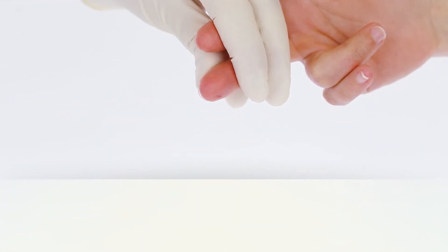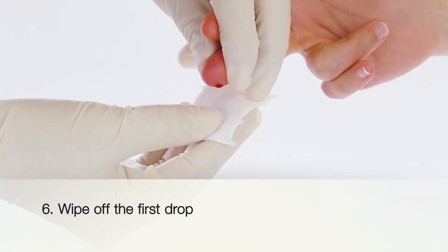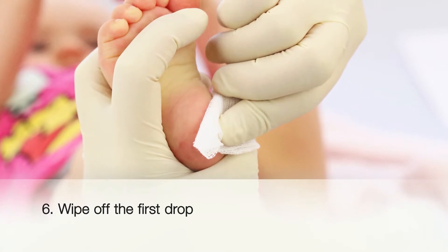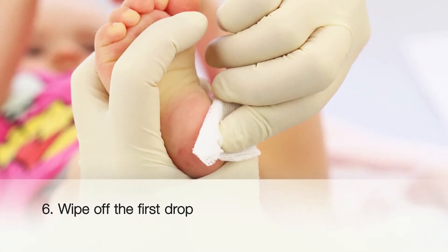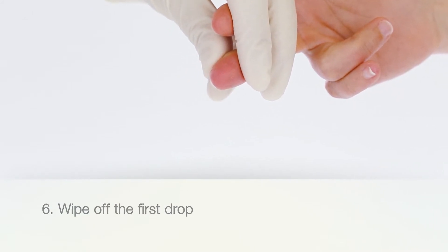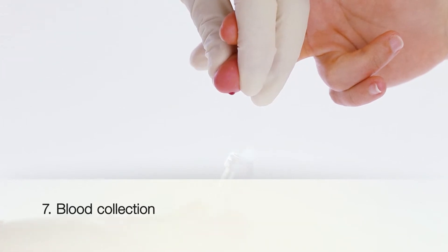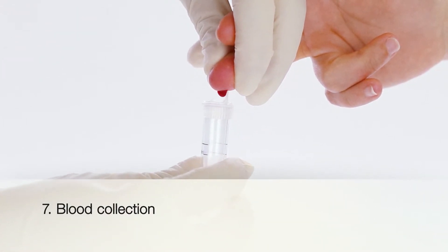Depending on the test procedure, it may be necessary to wipe off the first drop of blood with a sterile gauze pad. The first drop of blood may interfere with the analysis result due to a high content of tissue fluid. Hold the puncture site in a downward position. This prevents the blood from dripping away.